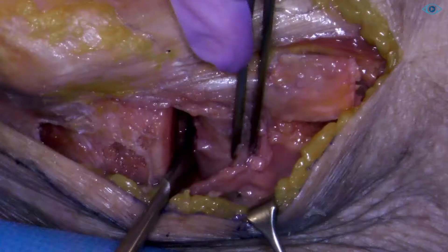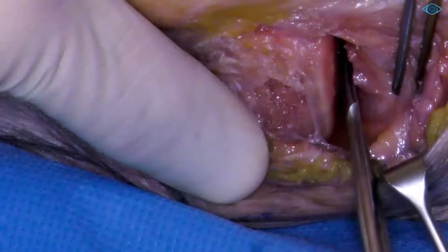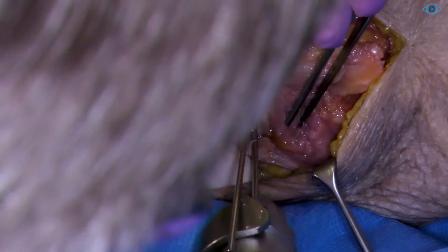Now we can free the lateral collateral ligament from small capsule structures. Here you can see complete dissection of the lateral femoral epicondyle with its attached lateral collateral ligament. This allows us to start the repositioning. Therefore, we lift the lateral meniscus and examine the central fragment. From this position we can nicely reposition it. Now we can close the tibial plateau, fixate it with a K wire, and control via x-ray.